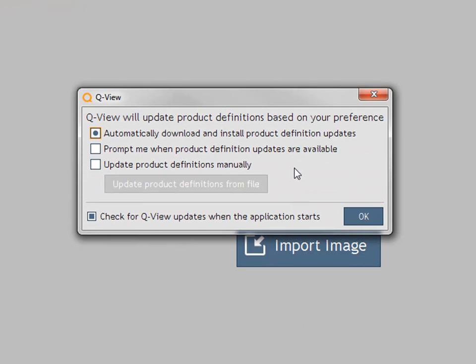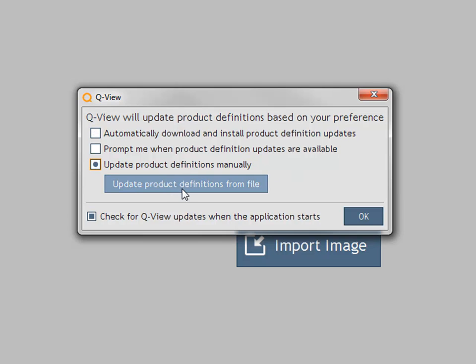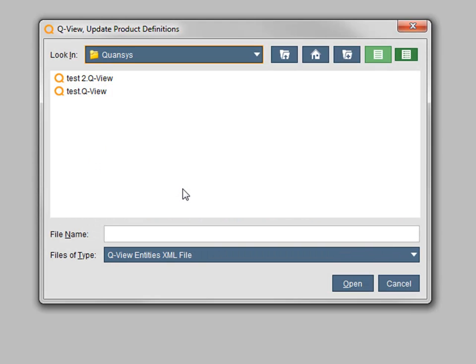To apply product updates manually, go to Settings, Administration, QView updates, and select Update Product Definitions manually. Then click the Update Product Definitions from File button. A file selection window will appear. Navigate to the product definitions file you received from Quansus and select Open.